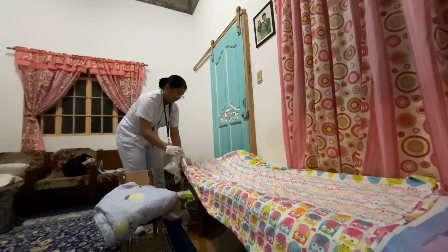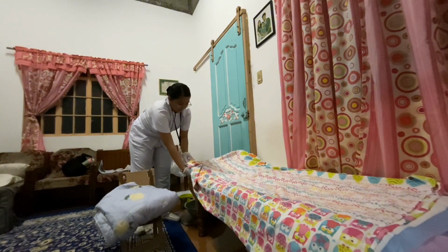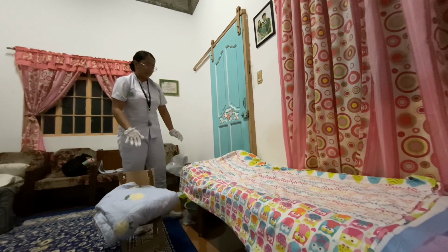Yung dito po, magagawa po tayo ng triangle method, which is i-hang natin siya dito, then ipapasok po natin yung dito para ganyan po siya. Malinis po siyang tignan. Same with the other side.